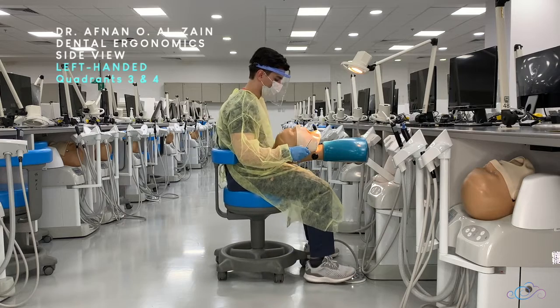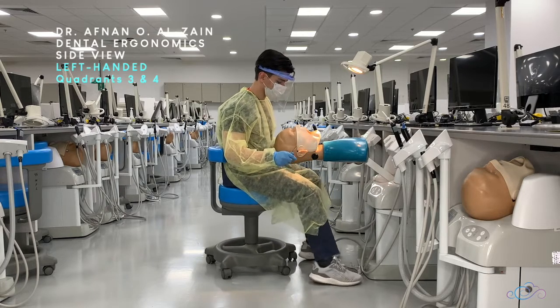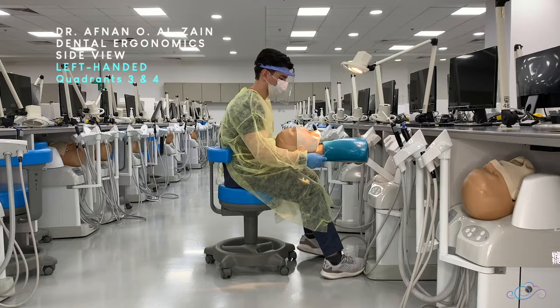When working on quadrant one, you tilt the patient's head to the opposite direction.